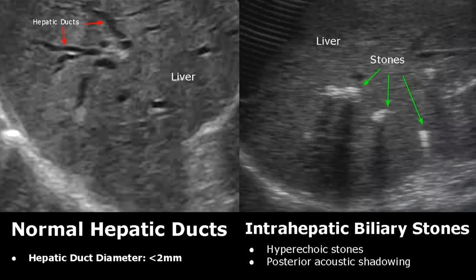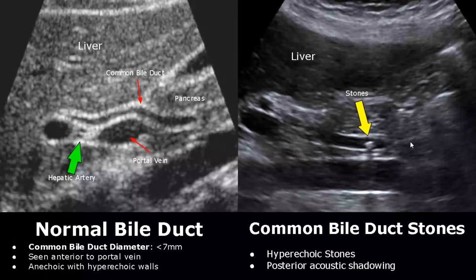Intrahepatic biliary stones will appear hyperechoic with posterior shadowing. In this image there are four stones within the hepatic bile ducts. In this next image we have a stone in the common bile duct — it also has posterior acoustic shadowing.